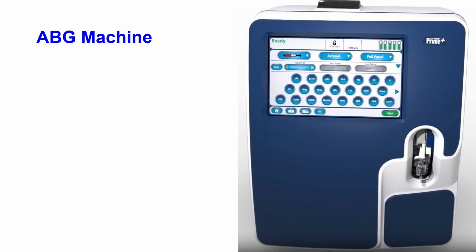Everyone knows this machine. This is an ABG machine. Every ICU has this machine. Here you will be able to do the blood gas analysis of the patient. Through a blood gas analysis, you will be able to identify the pH, PCO2, PaO2, and HCO3.